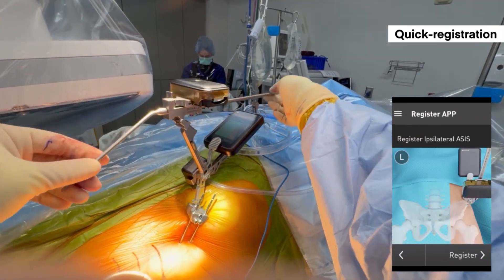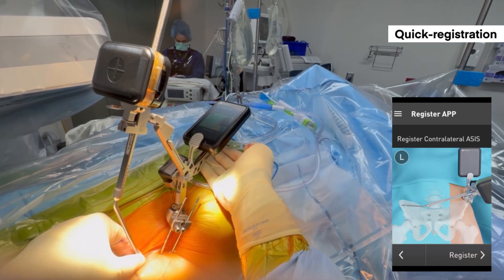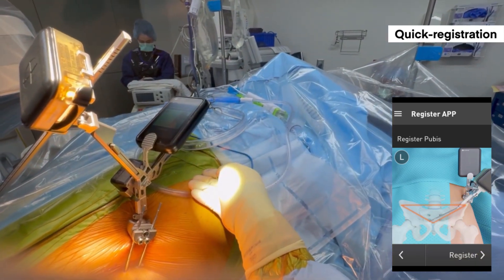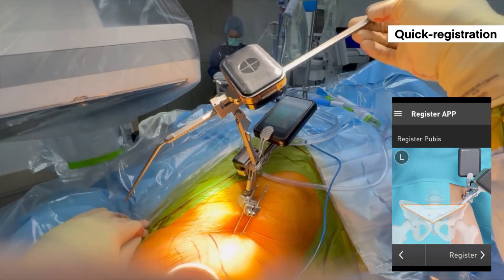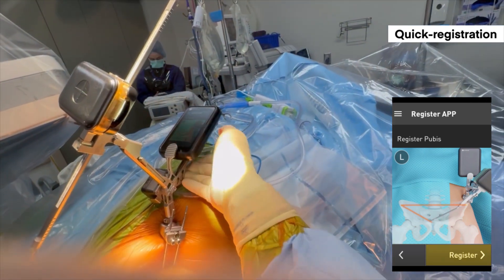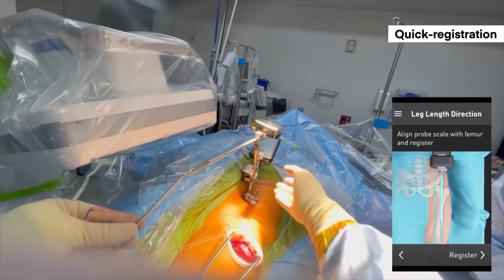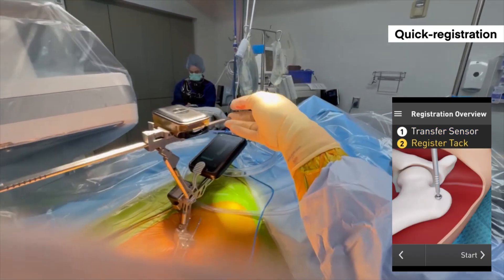Once the pelvic mount is secured, you can connect the Lantern Hip system. There are three points to register the anterior pelvic plane: first, the ipsilateral ASIS position; followed by the contralateral ASIS position; and then along the anterior pubic rami, you palpate and place the probe to get the third position. This will be important to determine your component and cup positioning later in the case. The fourth registration point tells the system the alignment of the leg — I typically place the probe facing the ipsilateral patella.